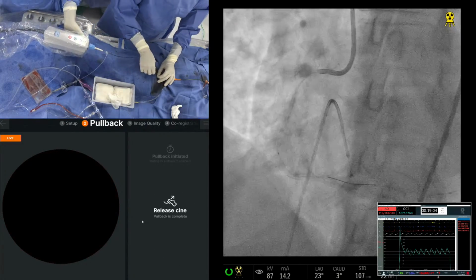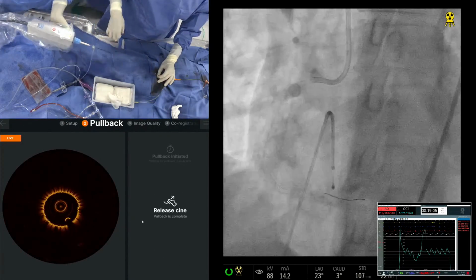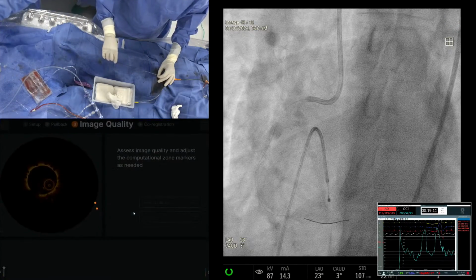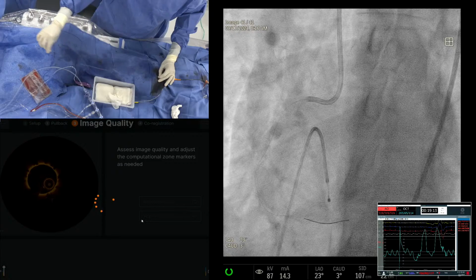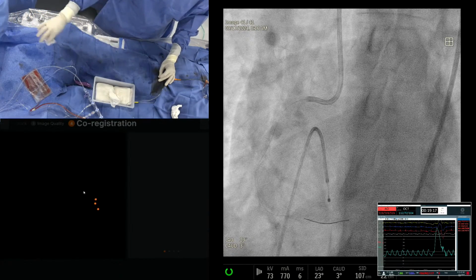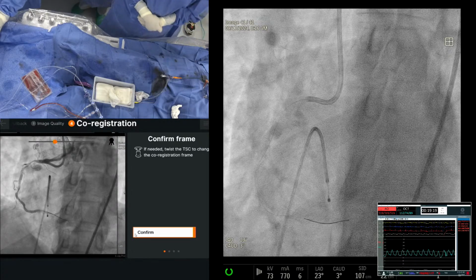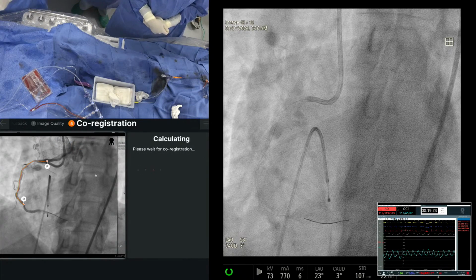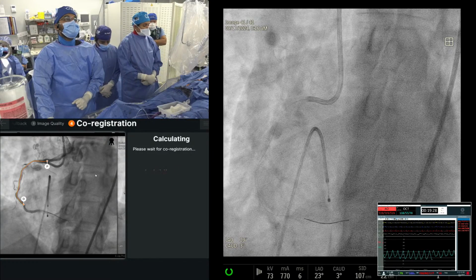Your centers bringing the machine. I think it's more how active a program you want to build. But you're right. If you really think about it, particularly the AI programs, maybe Anu can answer: OCT has done more in terms of AI implementation compared to IVUS, right? I mean, why should OCT be higher, particularly in India? No, I think it was just marketing.